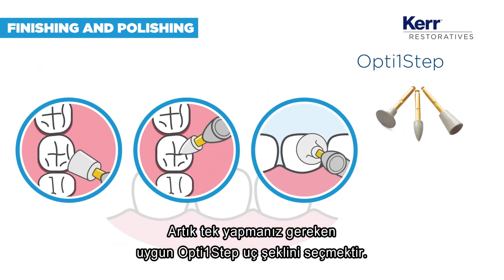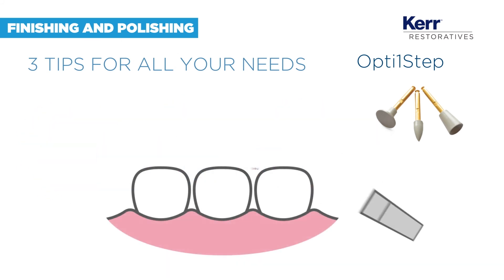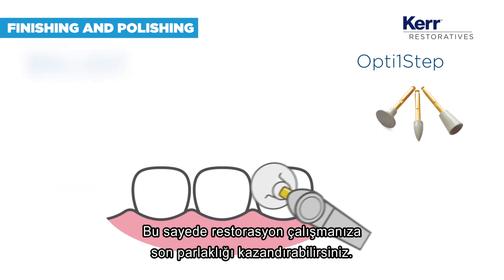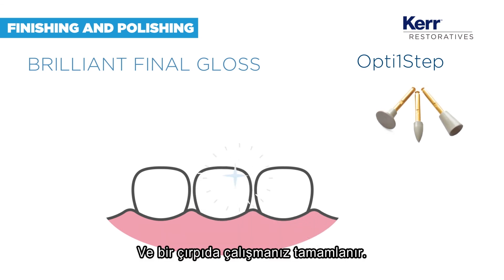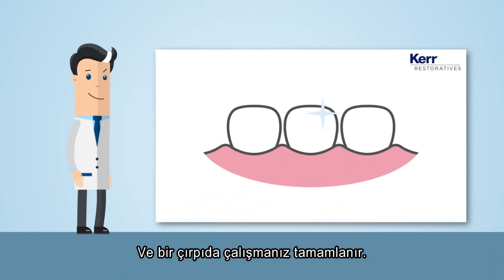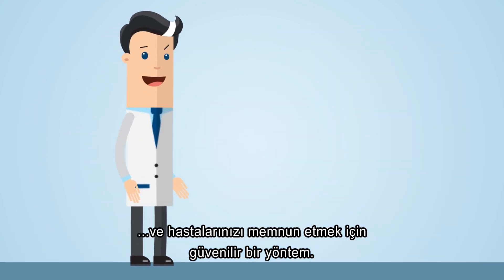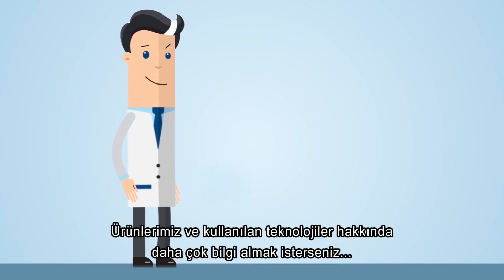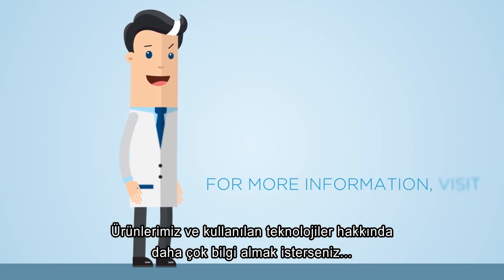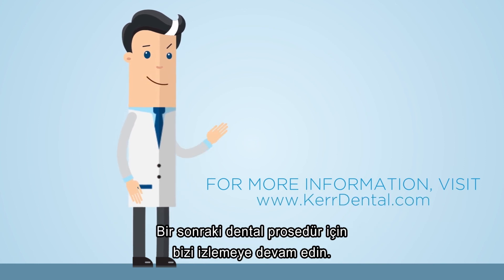Now, you just have to choose the right Opti1Step tip to give your restoration the final gloss it needs. And just like that, you are done — a beautiful and natural restoration and a sure way to keep your patient satisfied. Discover more about our products and the technology behind them on KerrDental.com, and stay tuned for our next dental procedure.